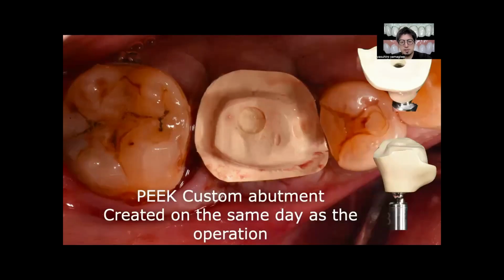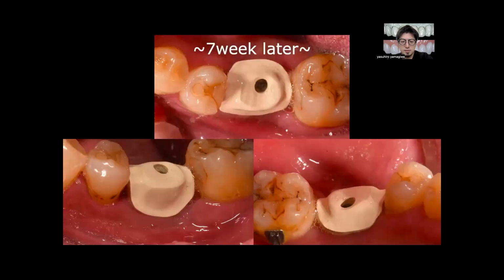For the PEEK custom abutment, the margin is set on the edge and made so that it does not hit the mating part. The joint uses a screw base. After 7 weeks, you will see that the gums are healing in line with the custom abutment.